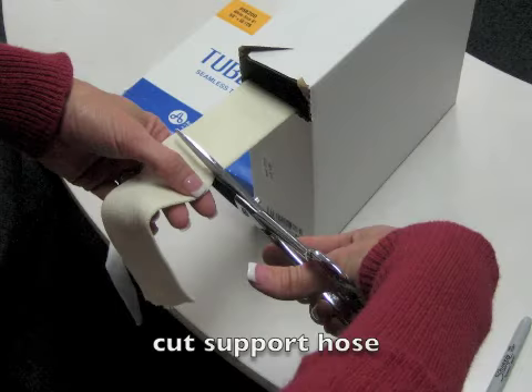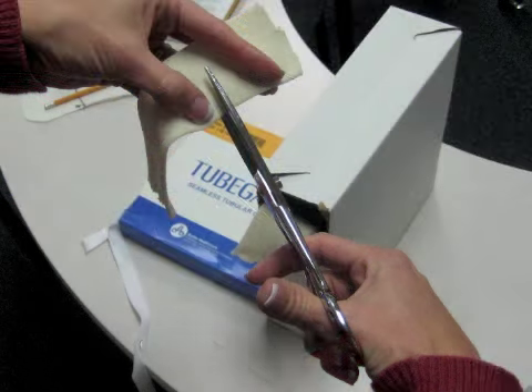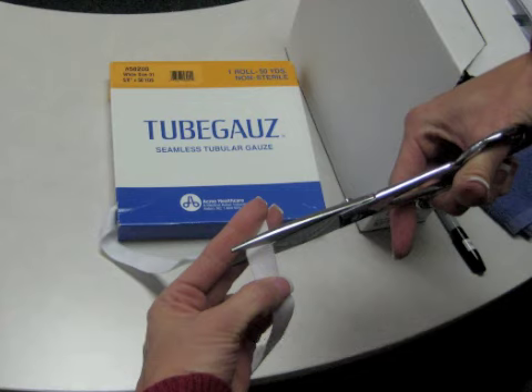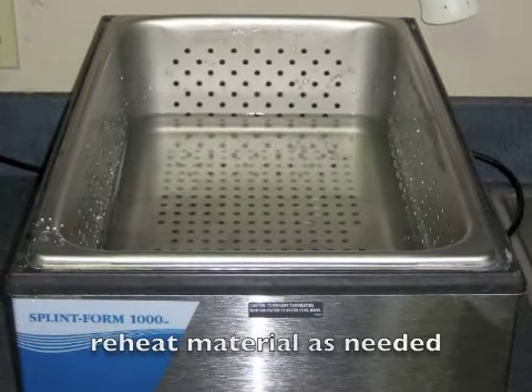Cut your support hose or stocking to be placed on the person's hand while making the splint. Keep in mind that support hose shortens in length when it is stretched out around the person's hand, so you may need to cut a longer piece. Then cut a hole for the person's thumb to go through. Next, cut a piece for the person's thumb — remember it will shorten when fit around the thumb. Place the stockings on the person's thumb and hand and reheat the material as needed.